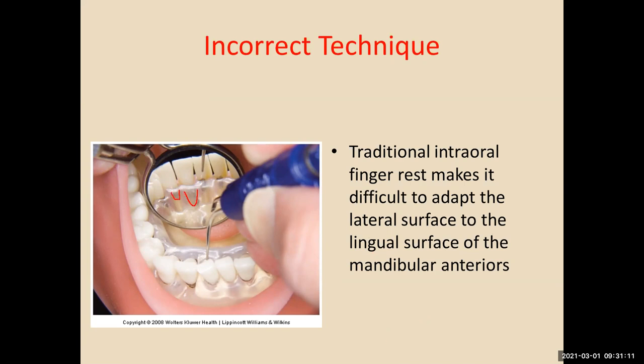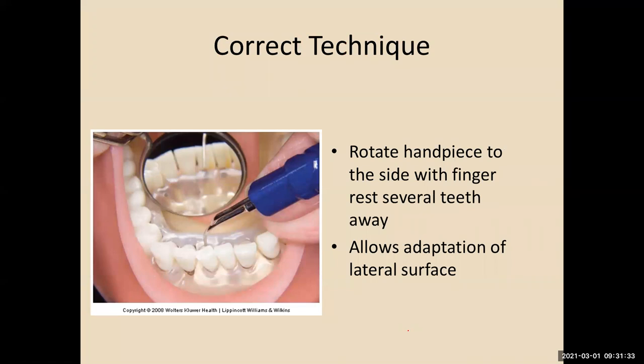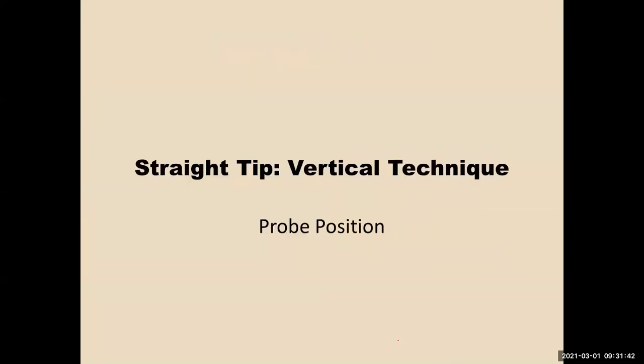On your boards, you will hopefully have a mannequin that will have pink gingiva and white calculus. Last year, they had black calculus like this, so the applicants could see where the calculus was. And they said, this might not be a good thing. So they made the calculus white for this year's class. But again, you want to make sure that side tip is adapted to the root surface.